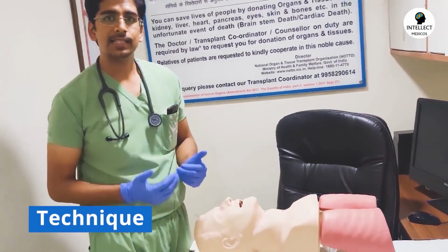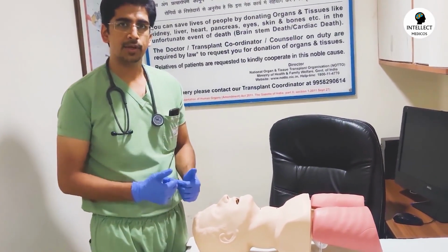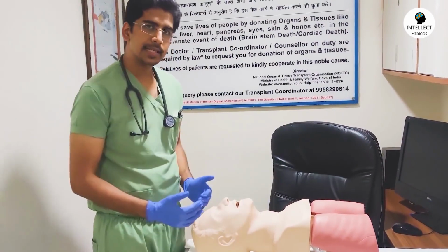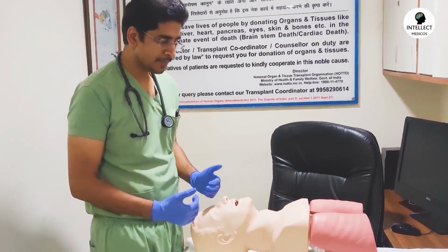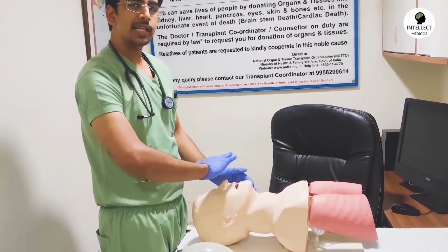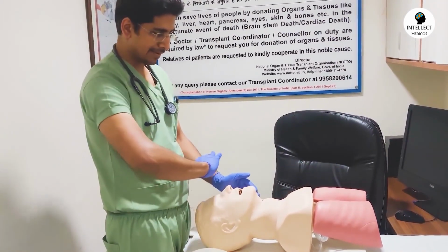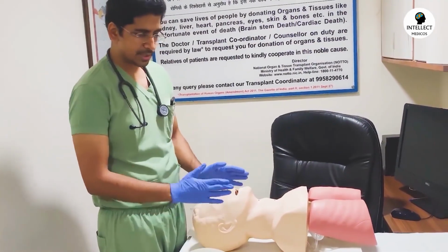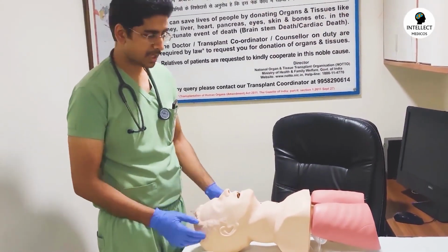First and foremost, when you are intubating a patient, the position of the patient as well as the position of the rescuer who is going to intubate is very important. The patient should be as near as possible to the rescuer, and the head of the patient should ideally be approximately at the level of the umbilicus. Although I don't have that bed over here, so I'll just demonstrate with this position.